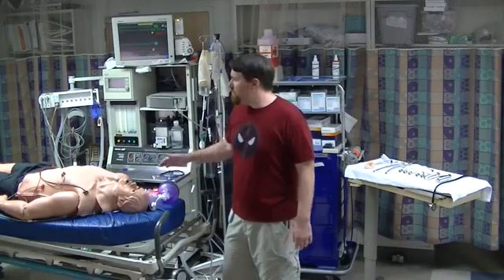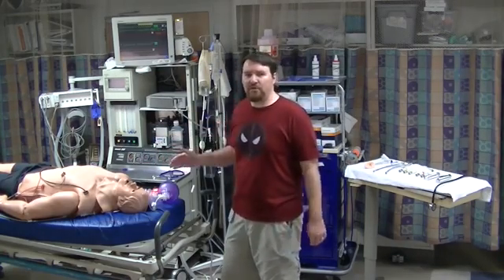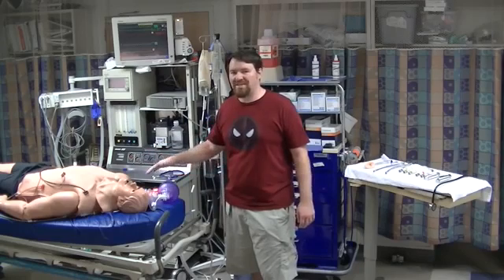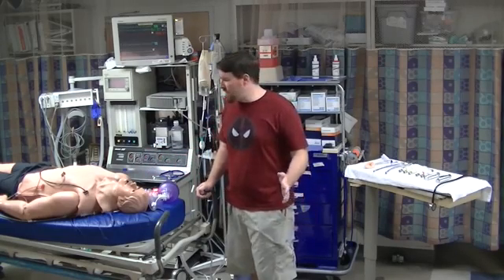The first thing you need to do is make sure you're familiar with the resuscitation bed. Prior to ever seeing a patient, there are going to be a lot of people walking around talking over each other. You can't be orienting yourself to your environment at the same time you're trying to critically think through the clinical skill you're about to perform to save this gentleman's life. You need to know where everything is.